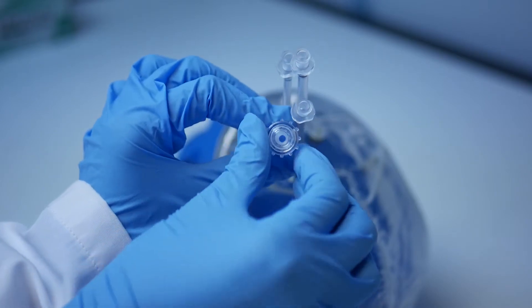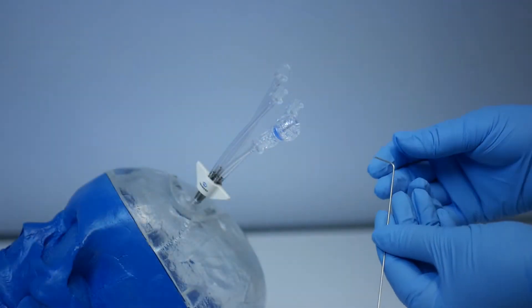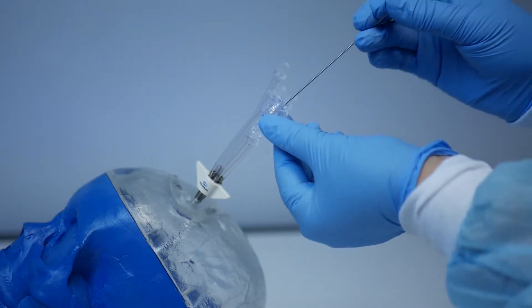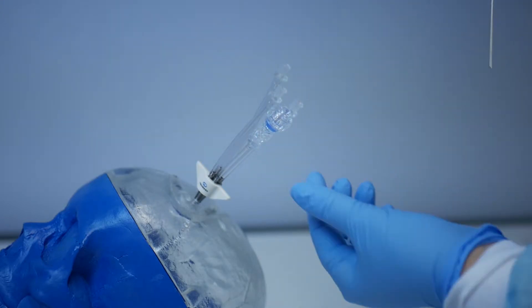Open the compression fitting on the short pigtail. Take the durapiercer that you set aside earlier and insert it through the compression fitting on the short pigtail of the quadlumen bolt. Remove the durapiercer after piercing the dura.